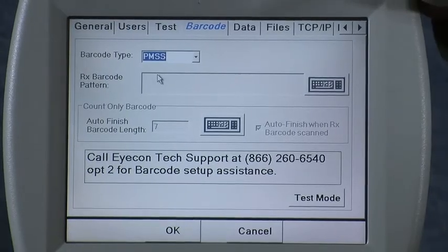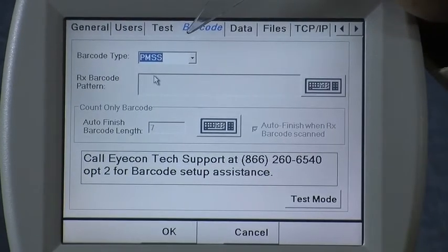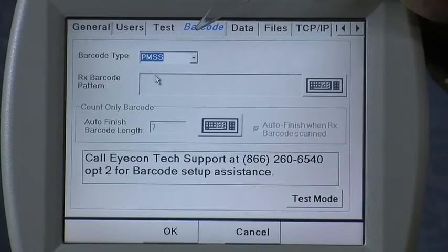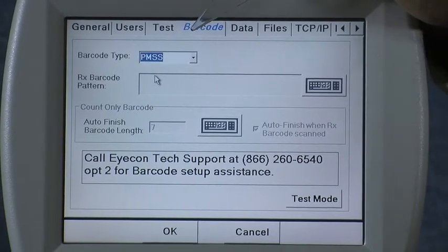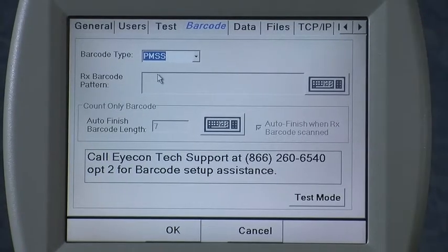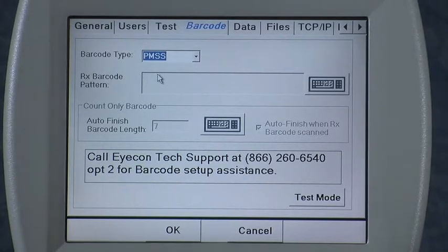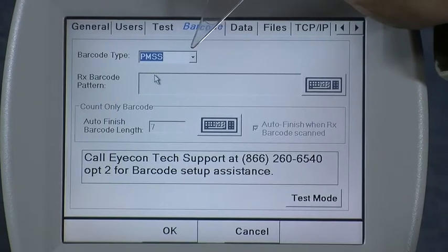The next setting, PMSS, for pharmacy management software system, is used when you have an interface between the icon and your software within your pharmacy. You select this if you have that interface, in which case the pharmacy system will send out all the prescription data to the icon as each prescription is released. There is no additional setup required for that menu.